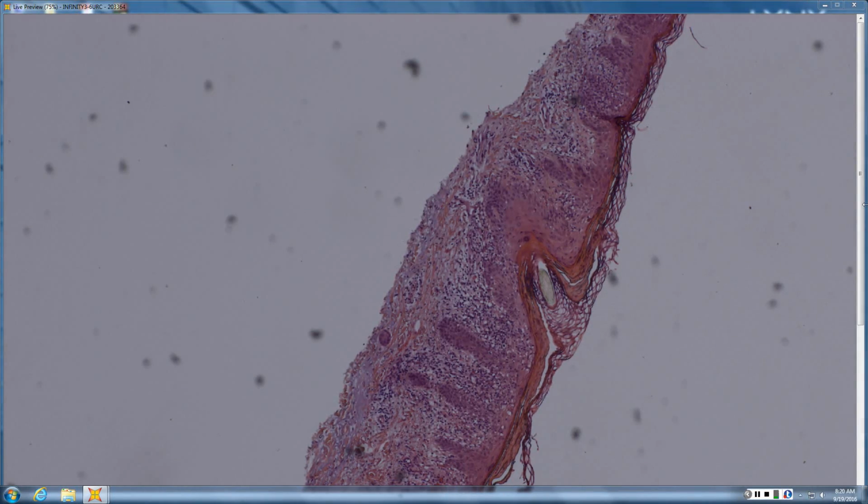I'd look for plasma cells, I'd look for endothelial swelling, I'd look for an interstitial busy dermis. In this case, I see all the lumens to my vessel. That's more PLEVA. The other thing that helps differentiate, if you have PLEVA, you usually have neutrophils packed in the vessel lumen. Whereas in syphilis, there usually is no vessel lumen because of the endothelial swelling.